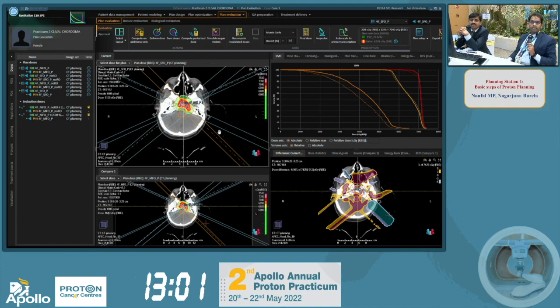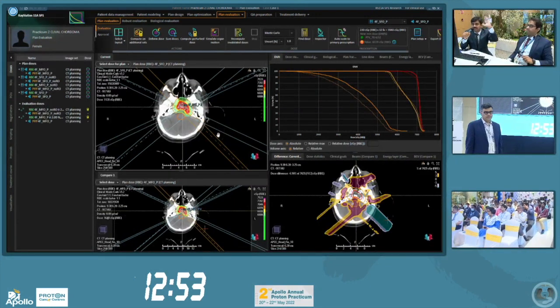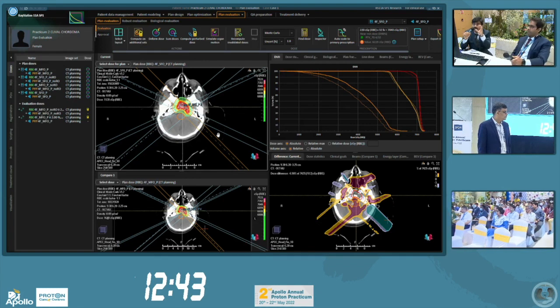Exactly. Even if there is a hardening material, I already said you have to tackle it in the first step itself. If the shunt changes, we usually check with the QACT, and if there are any changes, you have to do the replanning. So if there is an uncertainty, not only the shunt, the setup uncertainty is there, range uncertainty is going to happen. SFO, practically, you can say, is going to be more robust.